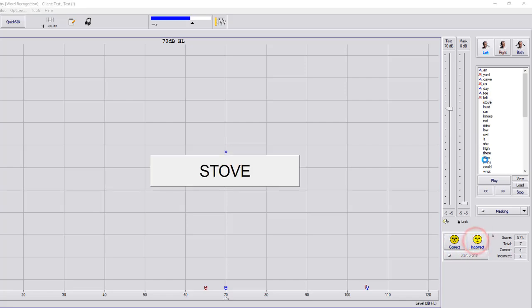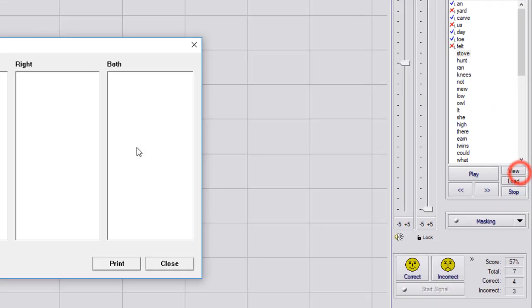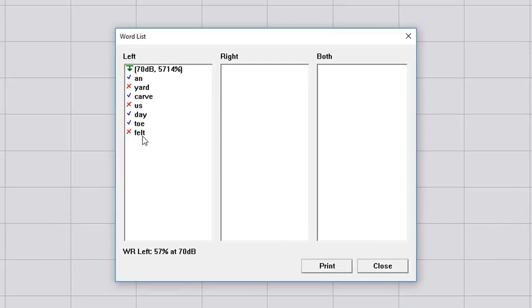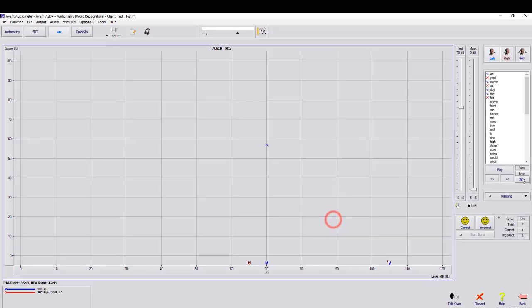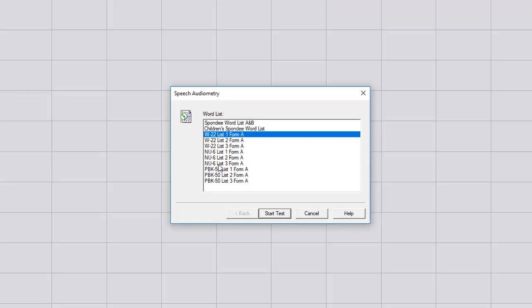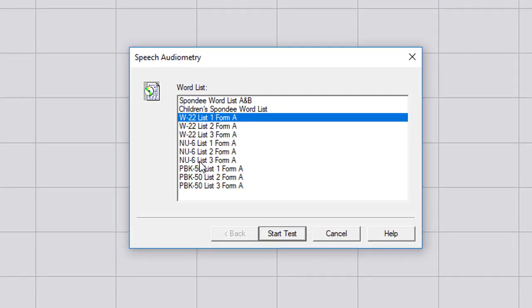Again for your view and load, you can always select view. It's going to pull up the word you got correct and incorrect. And of course, you can always print this out and put it into a file. Or if you need to load a different list, you can go to load, put in NU6, list three form A.